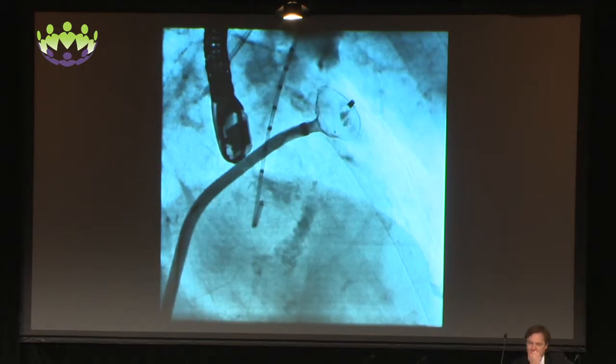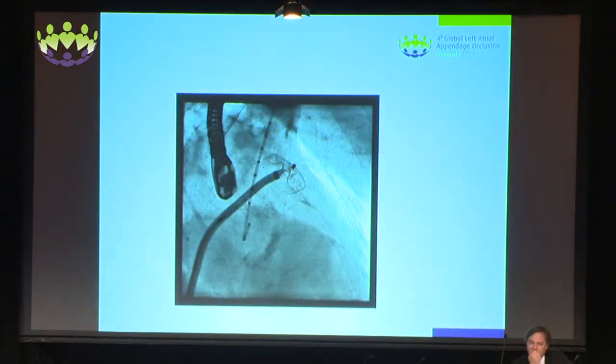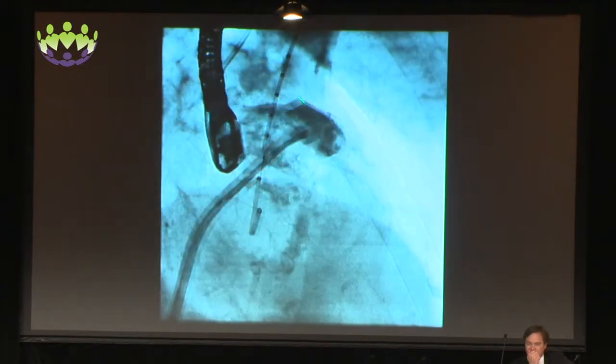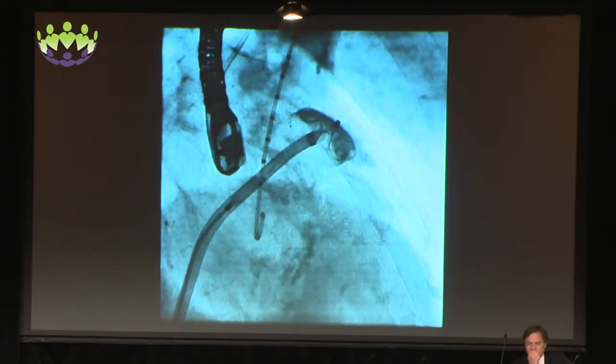So I'm now attempting again with slightly less counterclockwise rotation at this point to find that ridge. And here I'm feeling happy that I've caught the ridge. As you can see, there's a degree of compression, not as much as I would have liked, even though, if you recall, this was a 25 or a 1.8.